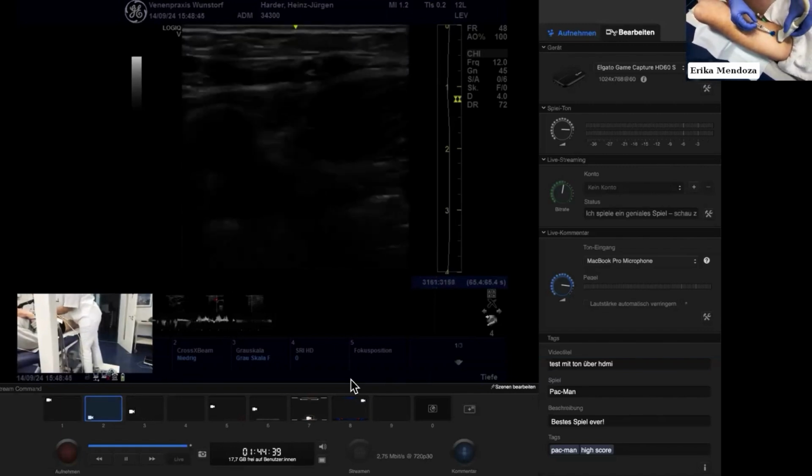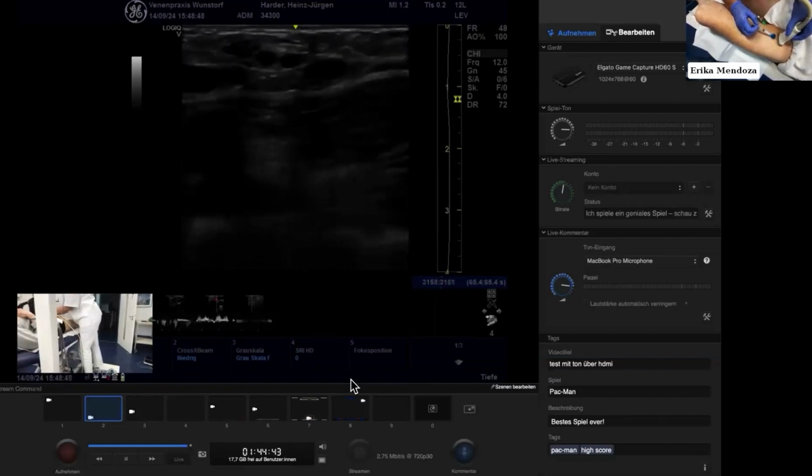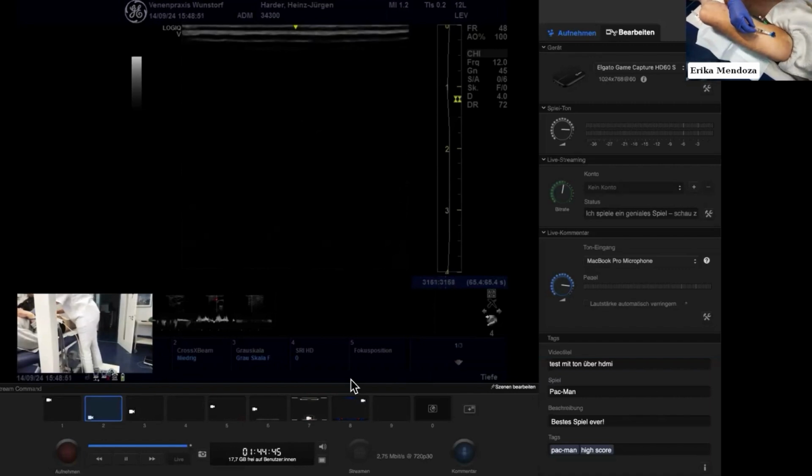Yeah. And Dr. Erika, this injection that you're about to give is both diagnostic and therapeutic. So diagnostic, because you'll see what's happening, and you'll see what the size of the vessel is and whether there's stasis or not. And of course, it's therapeutic. Yeah, absolutely.